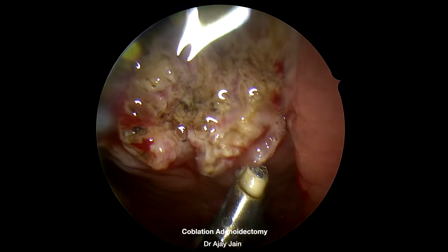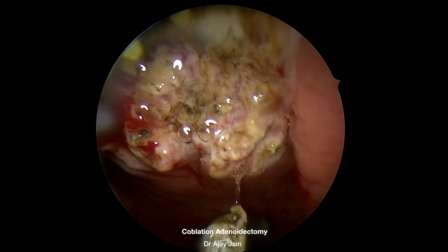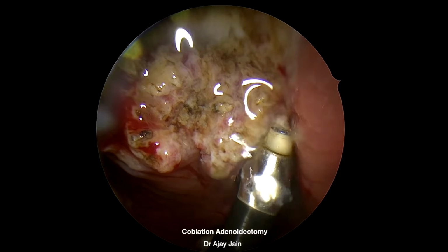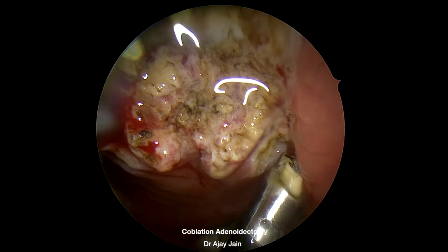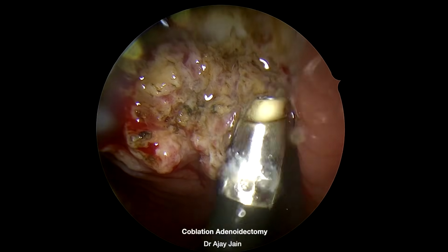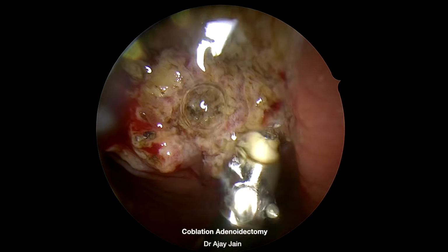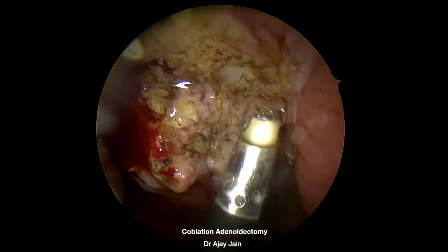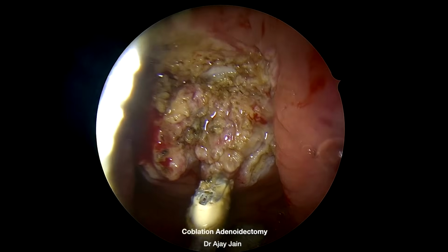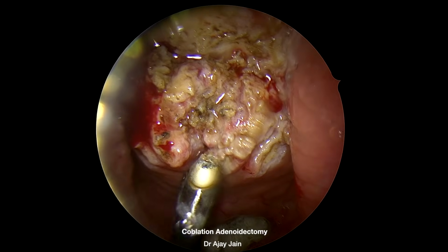That is a major disadvantage of doing adenoid surgery through the oral cavity, and then you have to go from inferior to superior, which is being popularized by many these days. But I like superior to inferior because I'm directly seeing the wand where it is working. I can go from above downward. So both techniques have advantages and disadvantages, but you do whatever way you are comfortable.